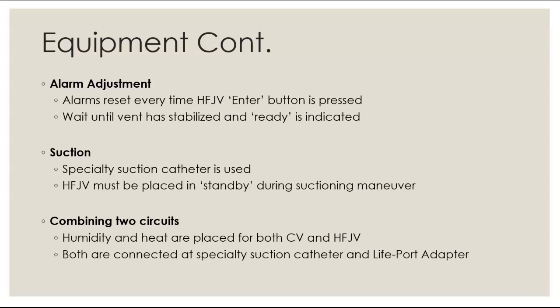So we are combining two circuits. Again, that happens at the hub of the suction catheter. We use humidity and heat in both conventional and the jet ventilators. And then we'll just review it, because again, I feel like the majority of new RTs find the setup of the jet overwhelming. That's why I'm breaking it down for you. Both are connected at the specialty suction catheter and the life port adapter.